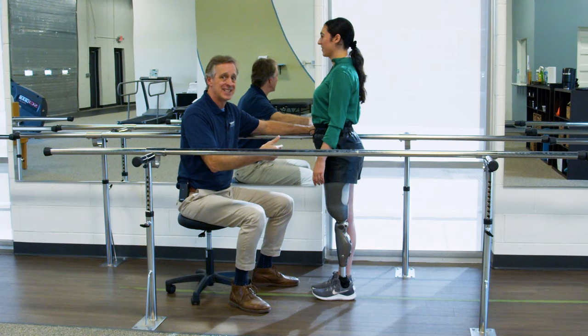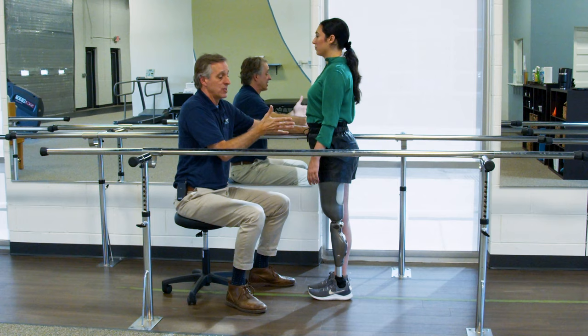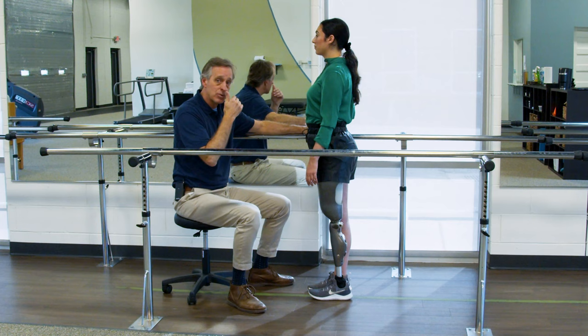But what it does is wear you out quickly, and it builds a lot of strength around your residual limb and in your core, and gives you a powerful short step when you need it. I'm at a party with different people and I can't just step on people. I've got to watch where my feet go. I've got to step, step, and then get around them. Okay? So the next one, if we go from a short step, is a long step.